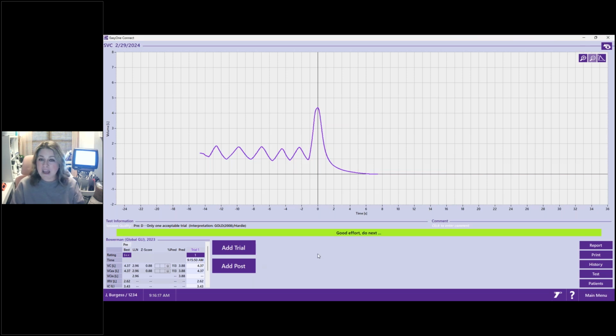All right, I'm going to go ahead and click add trial, and this time I'm going to do the opposite. I'm going to do the ERV method, where after baseline breathing, we're going to exhale first. So keep an eye on the coaching bar because it will automatically know that I have changed methods.